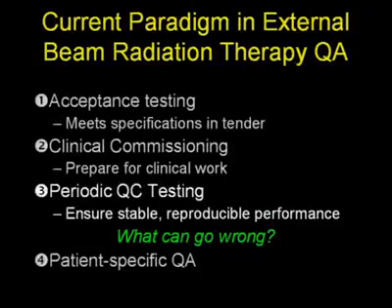Okay? So now the third step in this quality assurance paradigm, again outlined by the AAPM TG-40, is periodic quality control testing. Again, this is just to ensure that the performance of the device is stable and reproducible. And again, I would like to make a distinction. Quality control, in my mind, excludes specifically those tests that are mandated by regulatory bodies, such as the NRC or CNSC. And these, of course, need to be done no matter what, and should be considered separate from quality control in the context of this lecture.